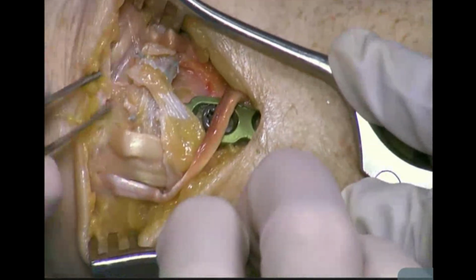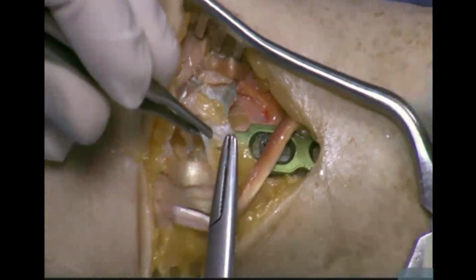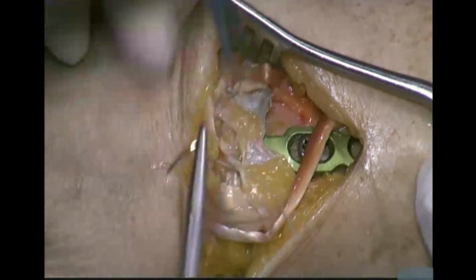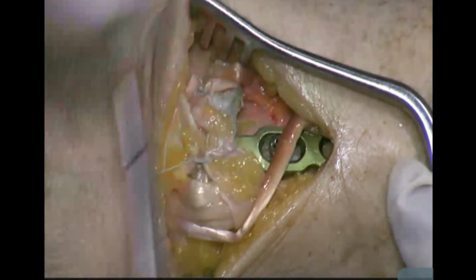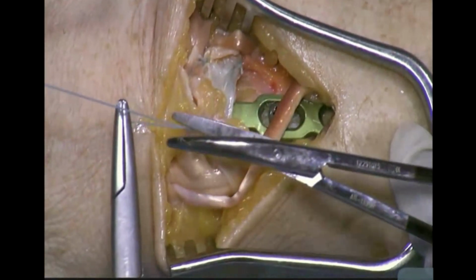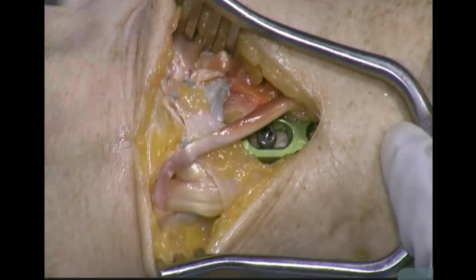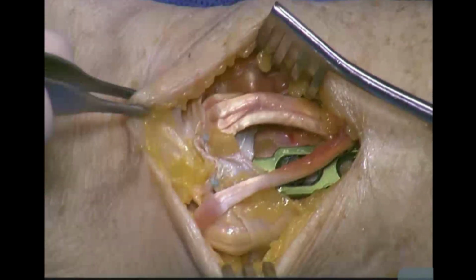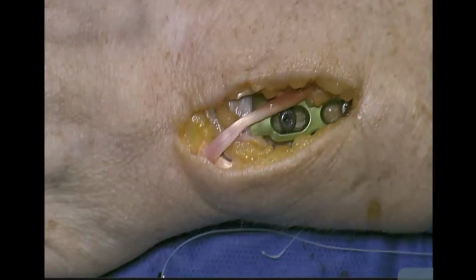And now we're going to move up here and grab our distal retinaculum. We know that we need roughly a centimeter of retinaculum for this to remain functional. And here we'll have no problem achieving that. Okay, so the EPL will be left superficial, and the rest of this will simply be closed up, and there we are. And the remainder of the wound is closed in layers as usual.